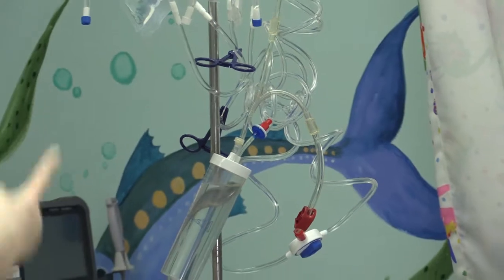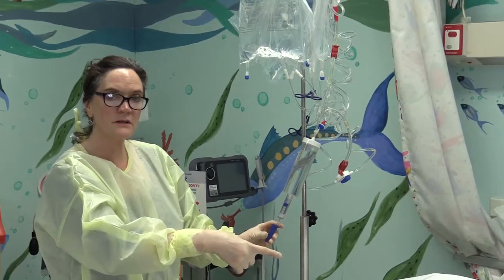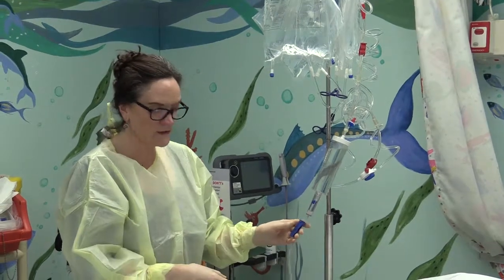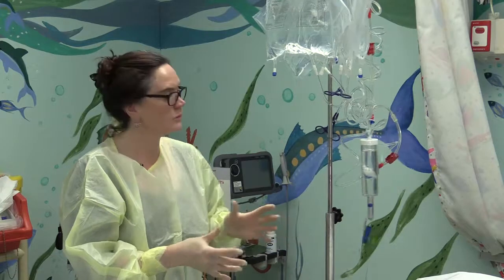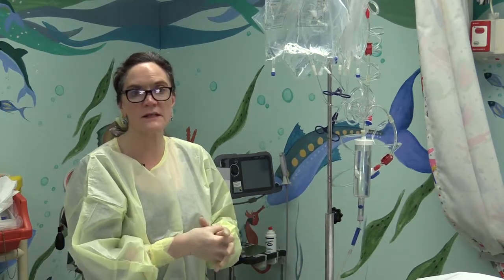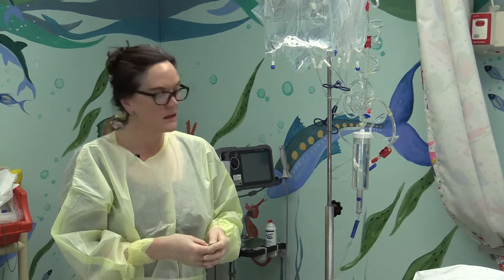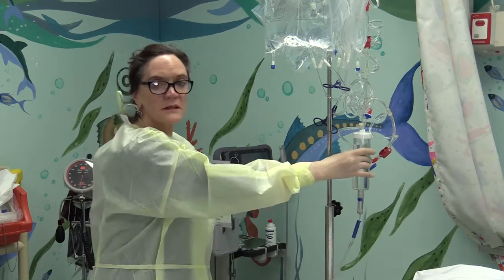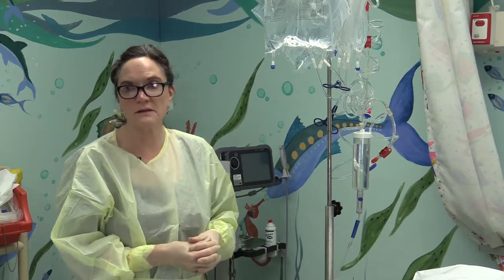The medication will then be instilled into the patient, and the catheter will then be clamped, and no dialysis will proceed for another 6 hours, and that will allow time for the antibiotics to be absorbed into the bloodstream from the peritoneal cavity. The antibiotics need to dwell for 6 hours minimum before recommencing peritoneal dialysis.